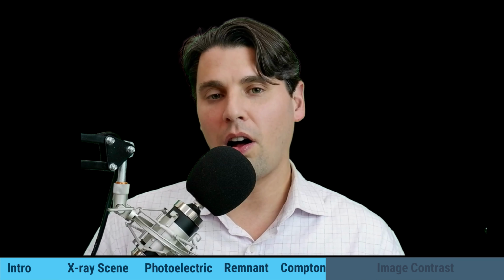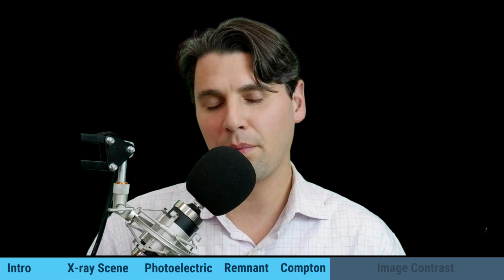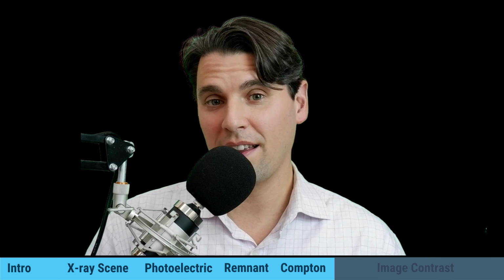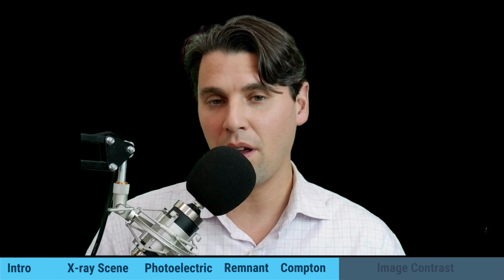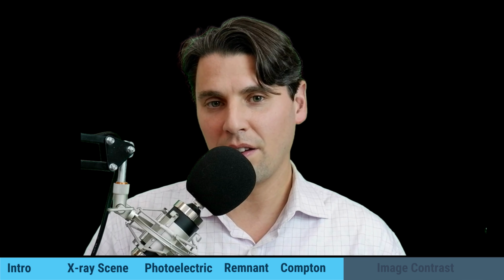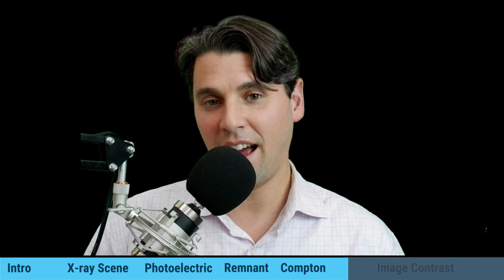So we talked about all the basic interactions which can happen. You also could have some small fraction of interactions via coherent scattering. In that case, the X-ray coming in and going out have the same energy. And generally, this is relatively inconsequential at diagnostic X-ray energies.